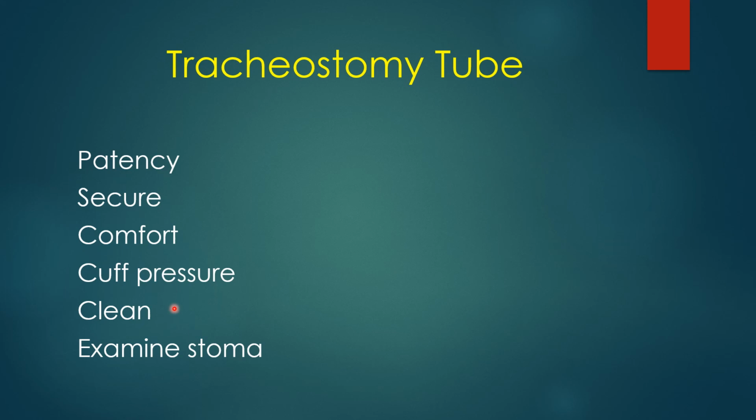You may be working in a hospital where the nurse does the trach care, and it may be where you do the trach care. But if you see a lot of secretions around the stoma, and the gauze is soaking wet with secretions, you can clean that, you can change that, even though it's not time for your scheduled trach change. So you want to keep that clean.